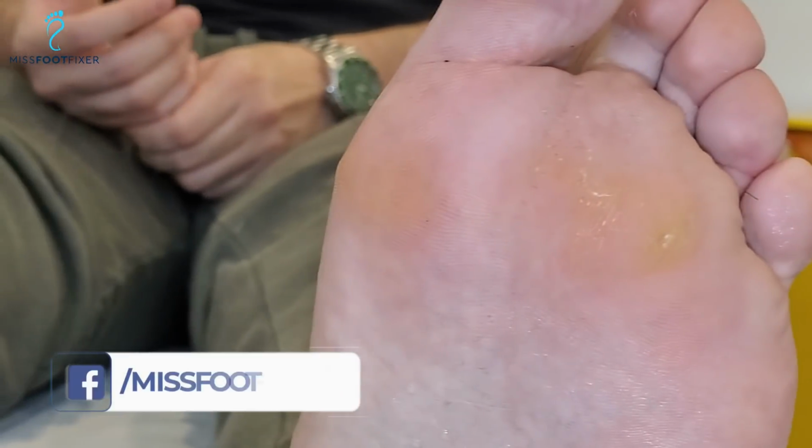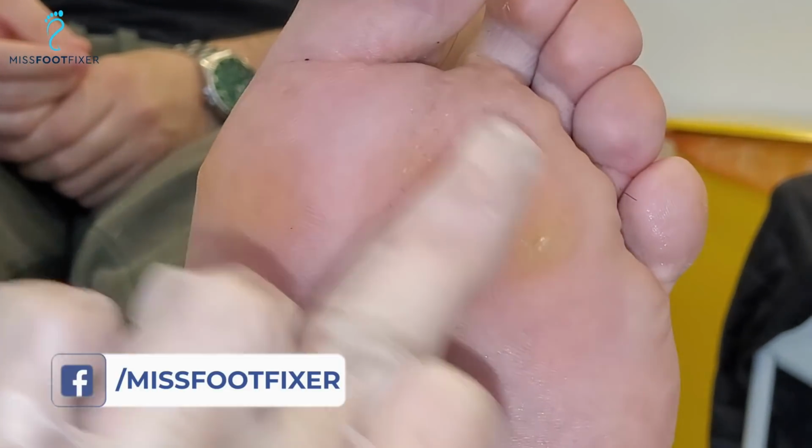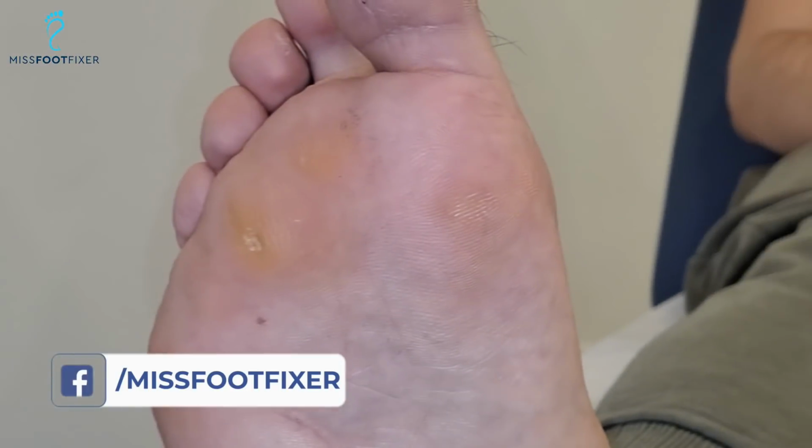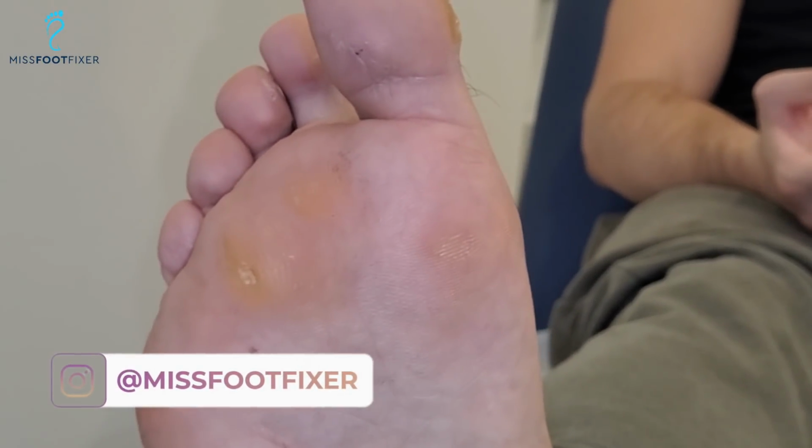Gentleman here, on both feet, he has some corns and callus. You can see on top of here. Is it quite painful as well? Yeah, it's quite painful for both feet. Here it is. Today Marion's gonna file that down.